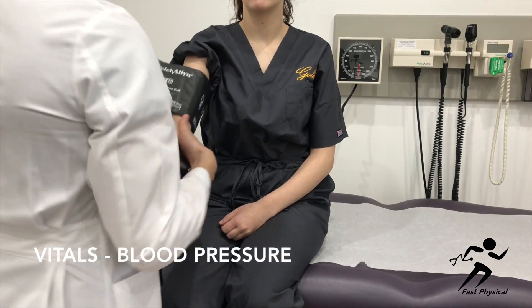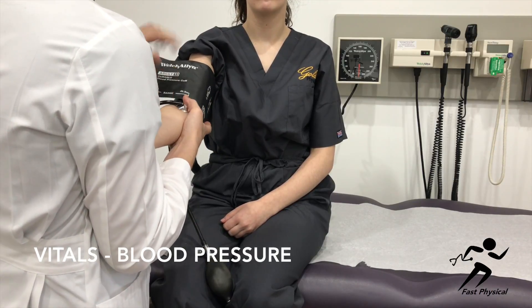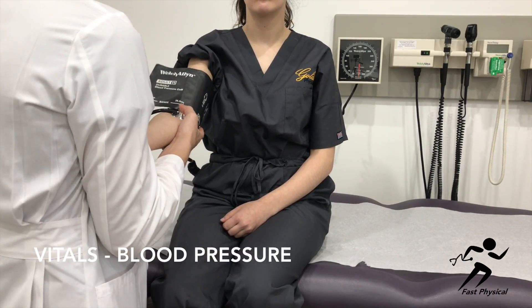Now you want to support the weight of the patient's arm with your own. The elbow should be approximately at heart level. Place the stethoscope in the antecubital fossa underneath the blood pressure cuff.